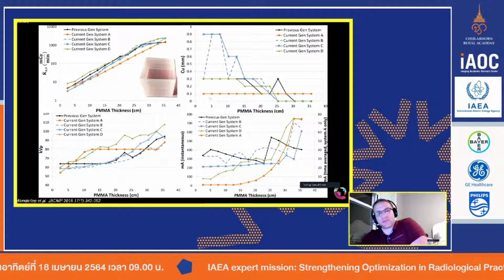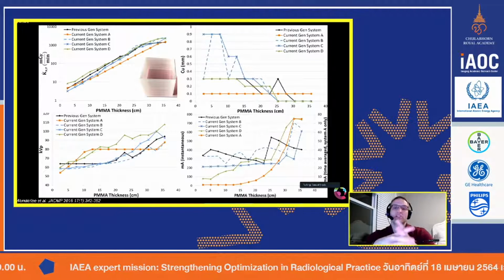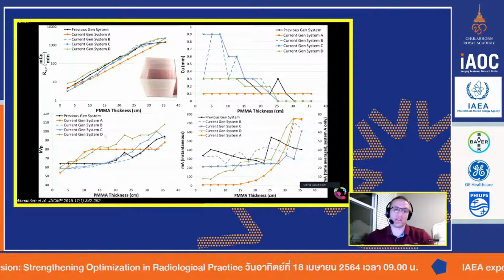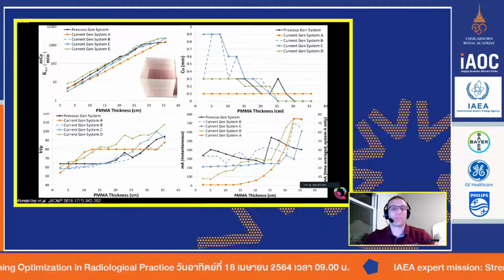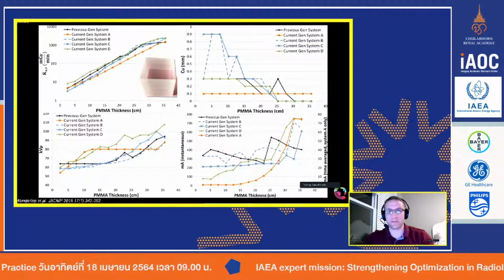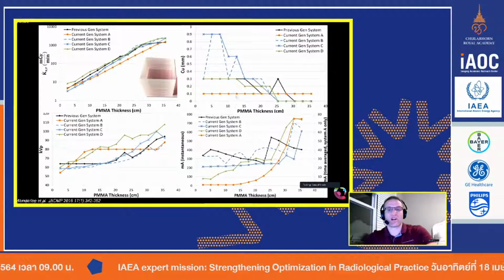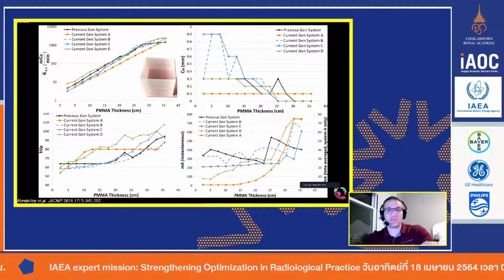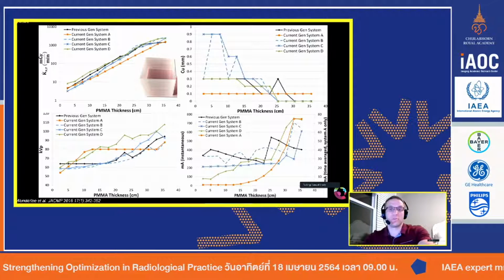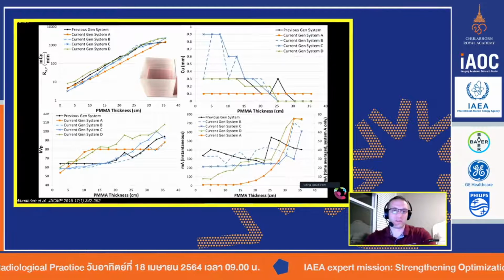This system, because it has a 0.1 millimeter copper filter, is going to allow you to have short pulse widths. So the contrast in this system will be slightly different because the KV changes slightly differently. But the resolution of this system will be probably different compared to this guy, system C, that has this blue X. So they start off with small patients. They're using 0.9 millimeters of copper. So great dose reduction for the patient, lower spatial resolution potential for this patient.